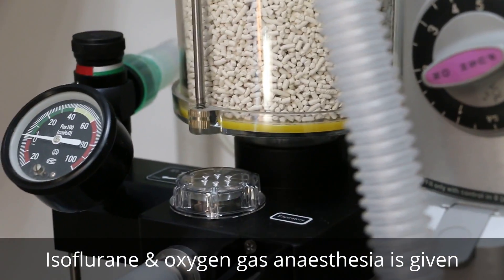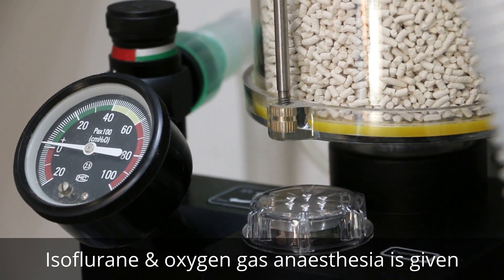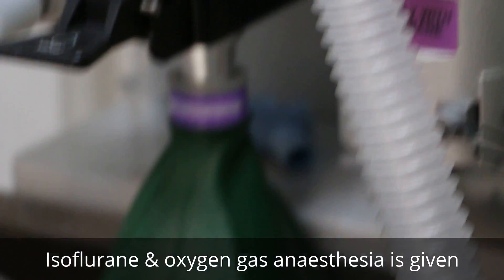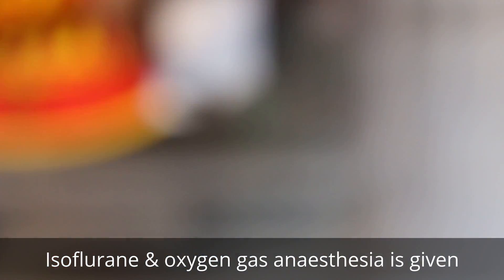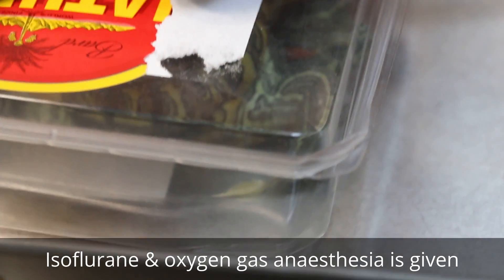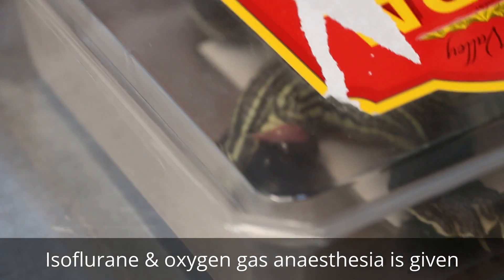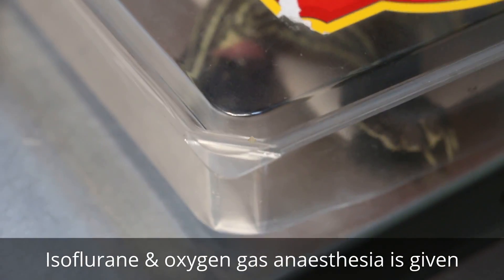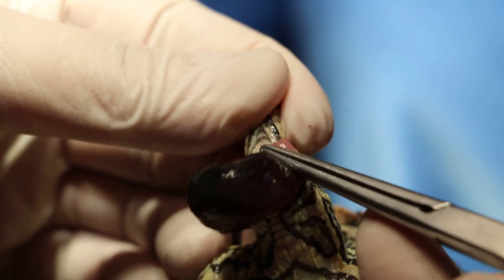Too tight and you cannot pass stool or urinate. Too loose, of course the penis can come out again. Now it's under closed circuit, and what happened was six months ago the same thing happened - same prolapse came out. So now we cut again. This is the prolapse penis.